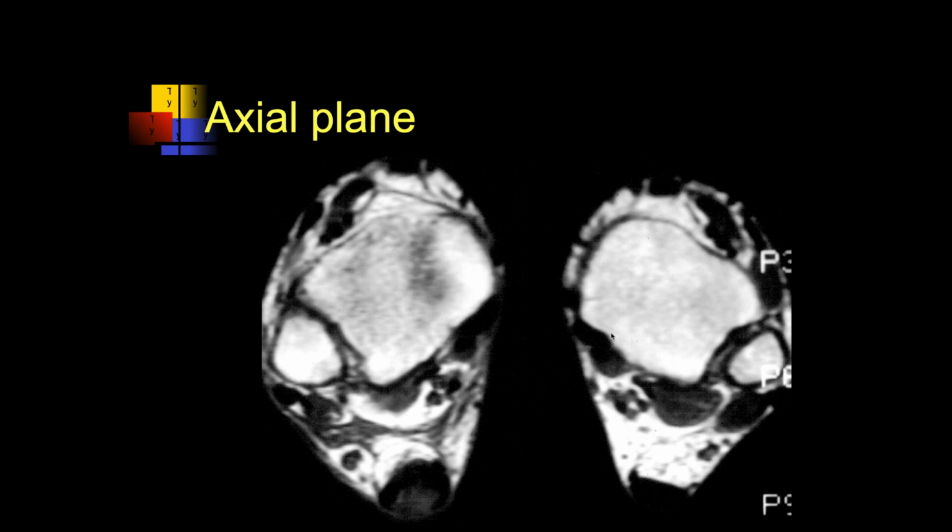So typically, when I dictate it, I don't put in types. I just describe it and say roughly the percent of the tendon involved. If you dictated the types, you would confuse orthopedic surgeons. You know, we can only stand so much knowledge, John. Okay, knowledge overload. All right.